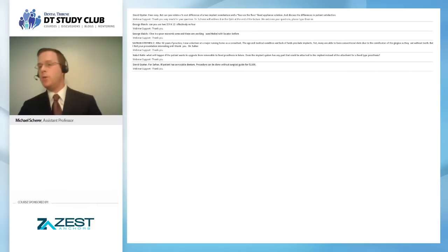Okay, here's a great question. Can you flap when placing these implants? Absolutely. What we've been finding at my university and also in my clinical practice is that we're flapping most likely right around 30 to 40% of the time.